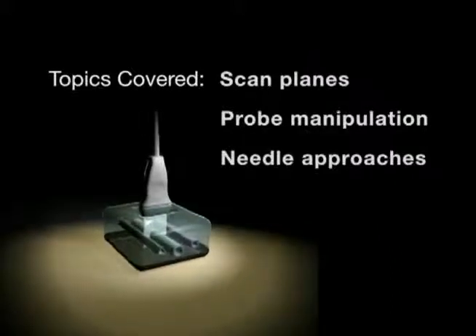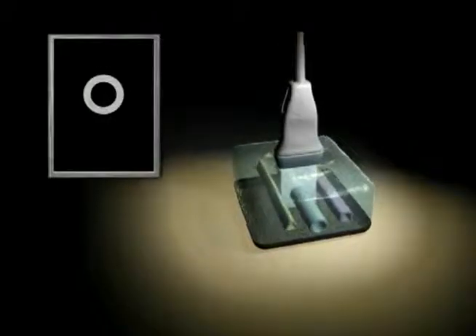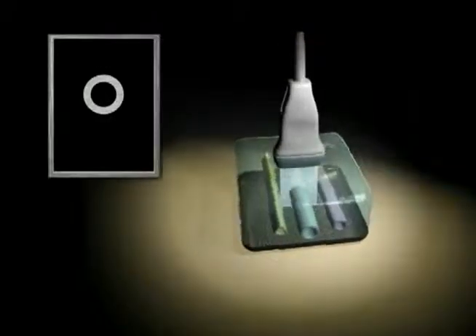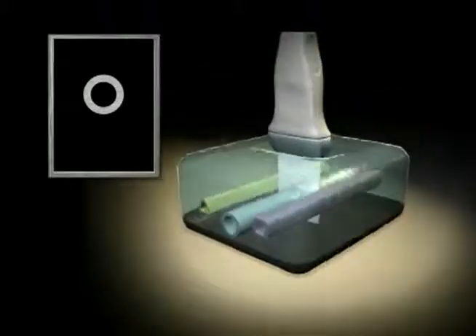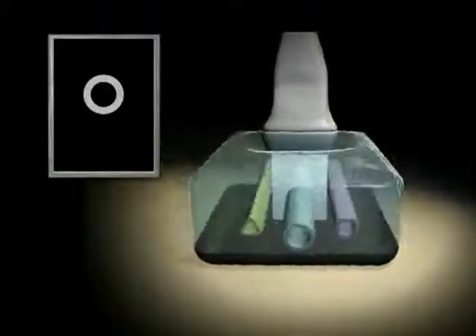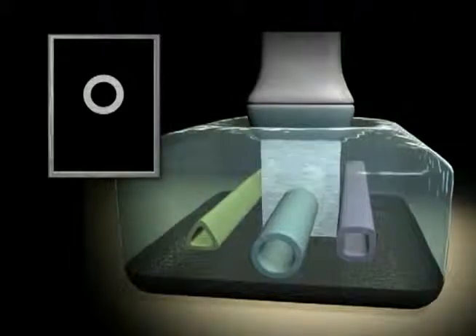In the following figures, we are looking at a schematic of an ultrasound transducer applied to a tissue equivalent phantom with 3 different embedded objects. A depiction of the ultrasound screen is inset. We generally image long cylindrical structures with an ultrasound beam that is essentially planar.